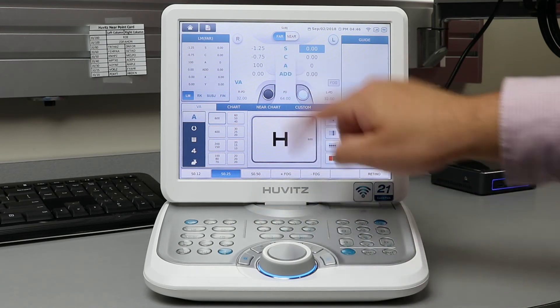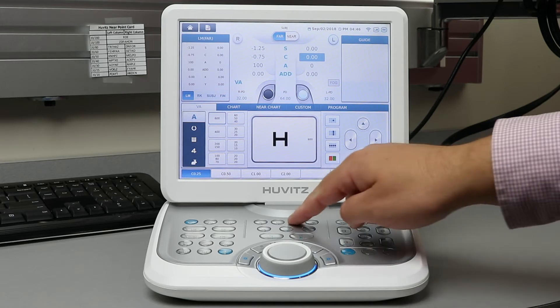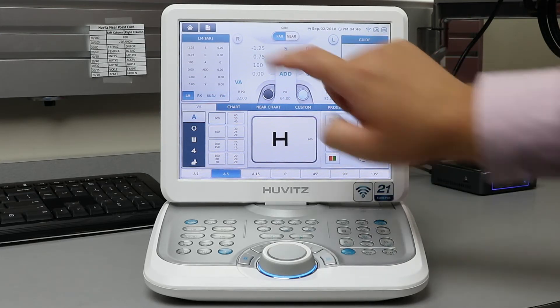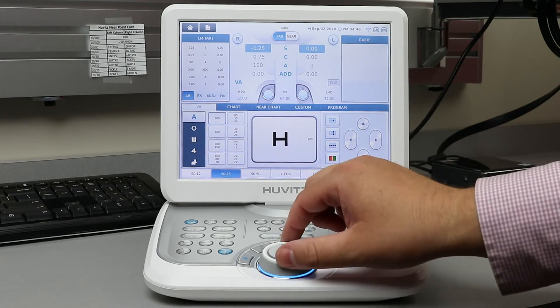You can change between sphere, cylinder, axis, and add by the corresponding letters on the keypad. Or utilize the touchscreen feature and touch the letter on the screen. Use the dial to change the value of each option as you see fit.